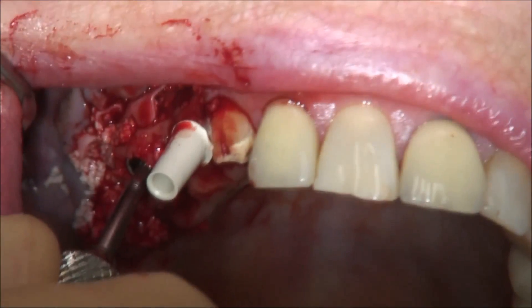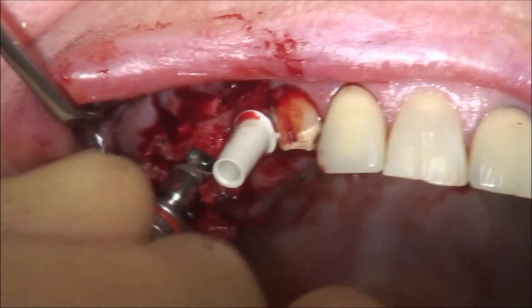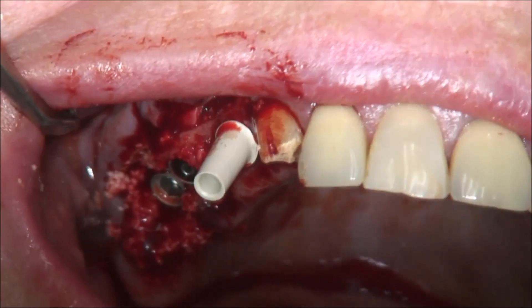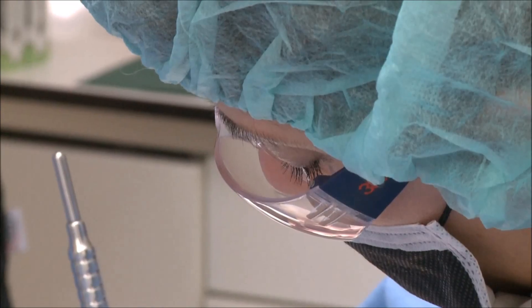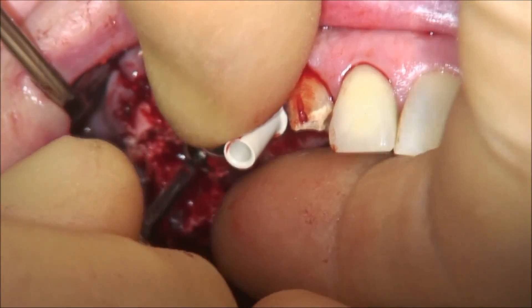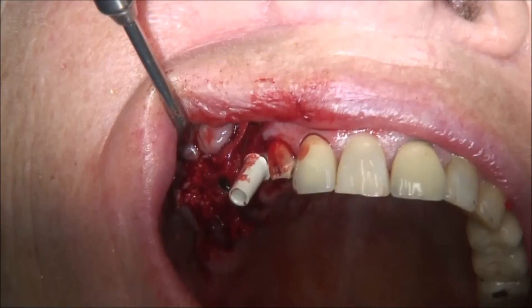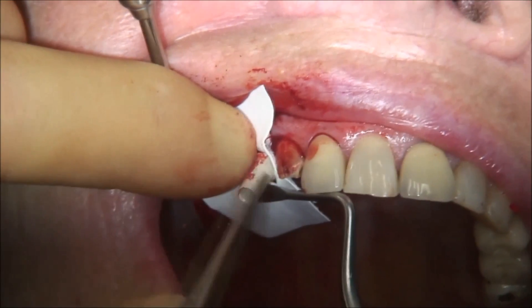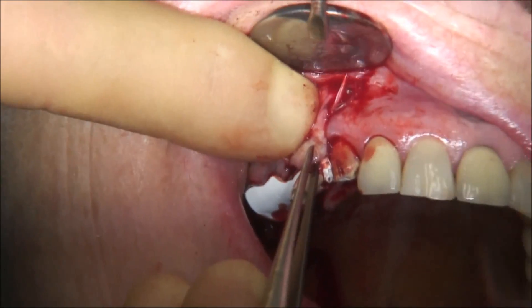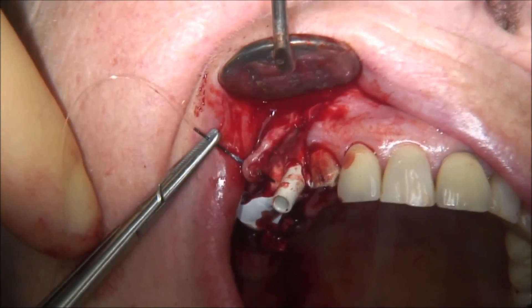Now we will do the same for the distal implant in the first molar area. We insert the implant with finger pressure, which is about 15 to 20 N·cm, and use cover screws. The bone density in this area is about D4, so we will have to wait 6 months to load these implants. The next step will be covering the augmentation with a membrane that has perforations done in advance. We use this collagen resorbable membrane as coverage for the buccal and palatal area, providing excellent coverage for the augmented area.